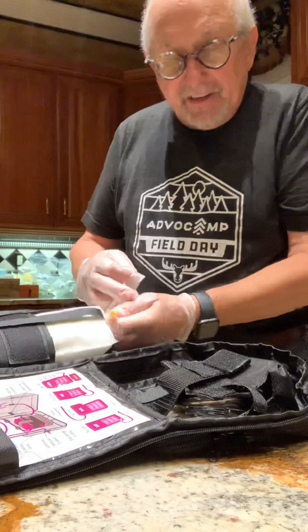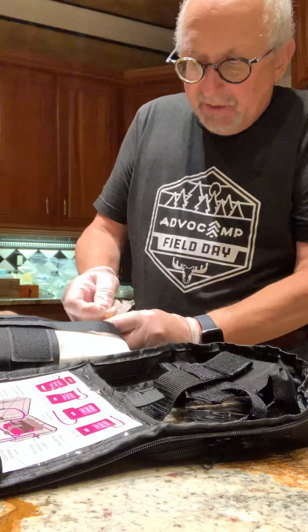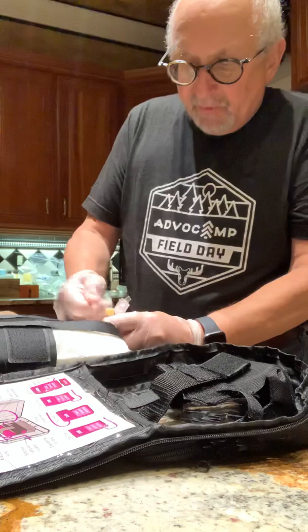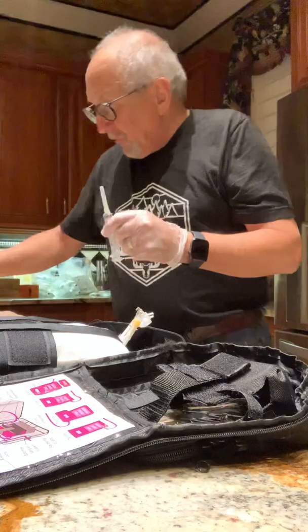The next step is the injection site in the feeding tube itself — the feeding bag. We're going to rub that very, very well. It's just a rubber cap and it comes exposed, so one never knows what's happened there, so we do a thorough job of cleaning that site.